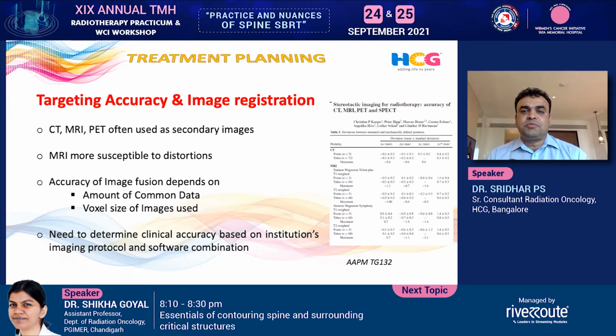When we are marking, the spinal cord, vertebra, and the CSF space are all marked separately. Don't just mark the overall cord cavity as the spinal cord. Mark exactly the spinal cord proper.